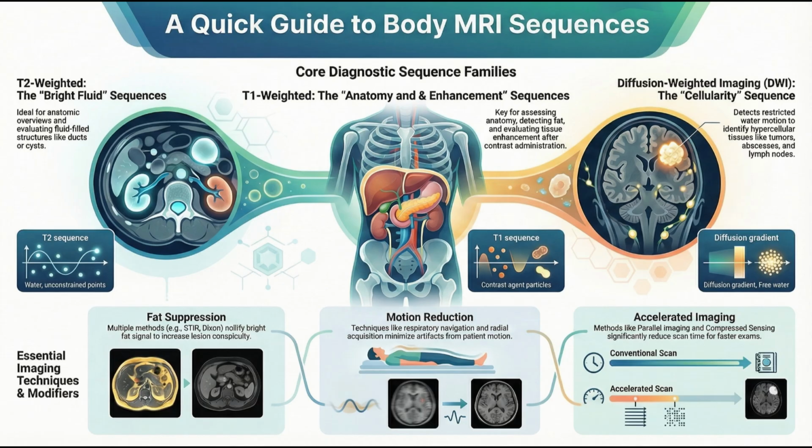And just quickly, for vascular issues, how do we capture dynamic flow? For that, you need time-resolved MRA, things like TWIST or TRICKS. These use really aggressive k-space-based sampling to get frame rates of 1 to 2 frames per second. It lets you map out the arterial inflow and venous outflow of something complex like an AVM, which is essential for planning.